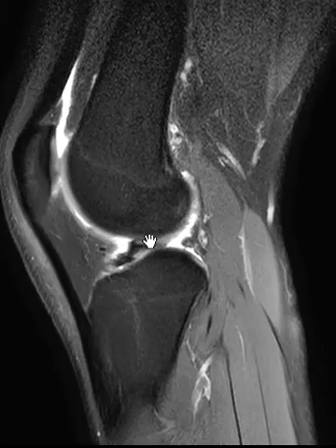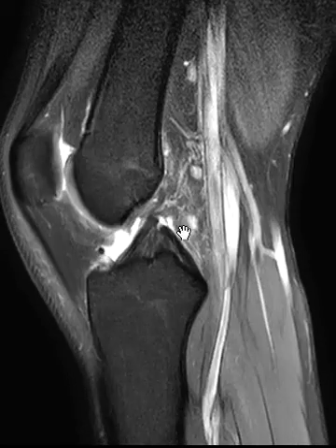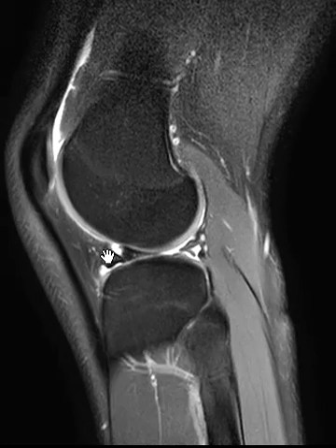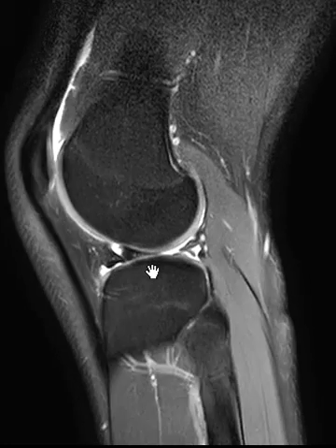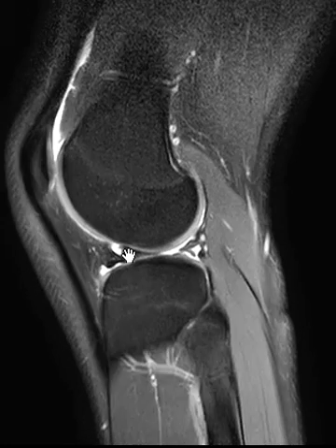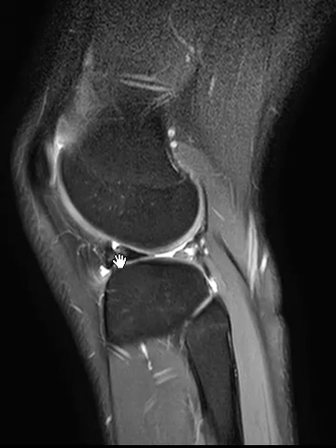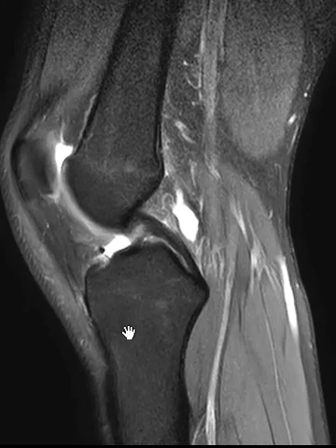Sometimes they're just all along the inner aspect; sometimes it can parallel the PCL here. Other times they're flipped forwards like this, and it looks like you have a double anterior horn. You can see how with the meniscus here, you can't fully extend the knee — there's too much pressure from that extra meniscus. This is a bucket handle tear of the lateral meniscus.